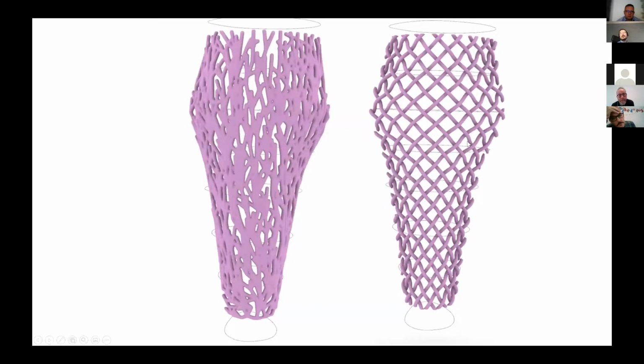On top of this, we have some more experimental generative shape generation methods that are done not using parametric CAD surfaces, but rather on a voxel-based or volumetric model. So here, instead of representing this geometry using surfaces or splines or solids, we are representing it using voxels.